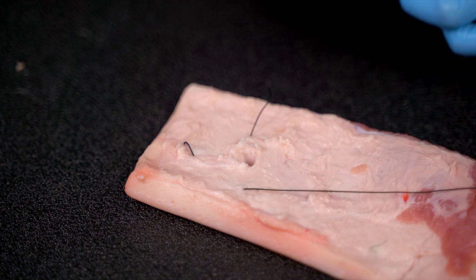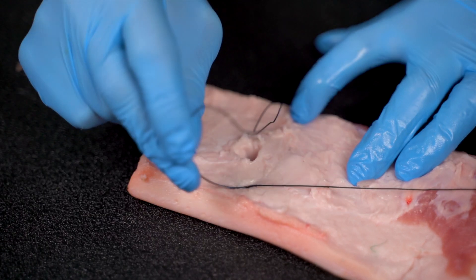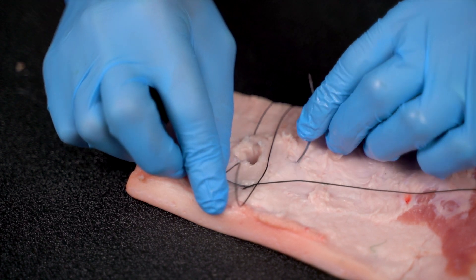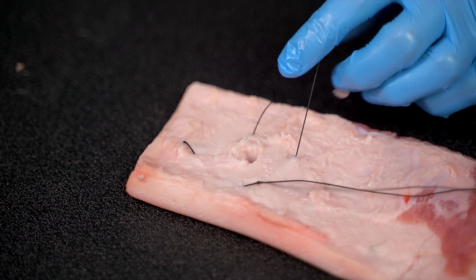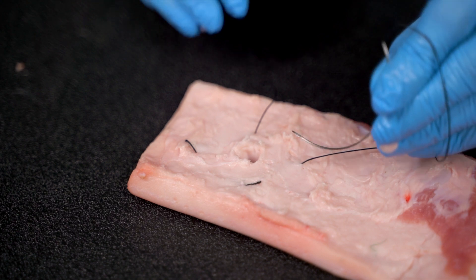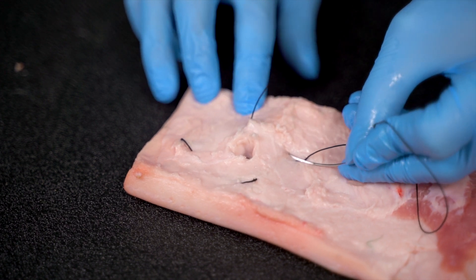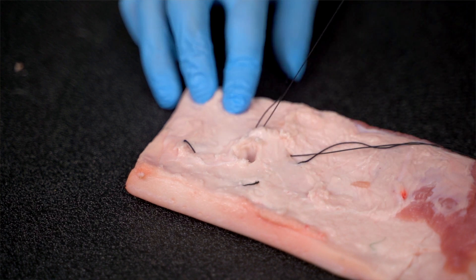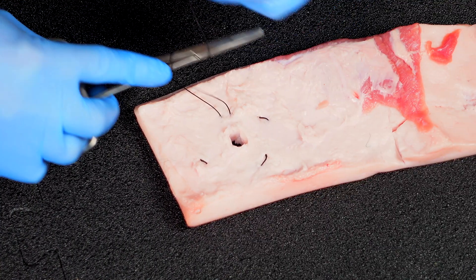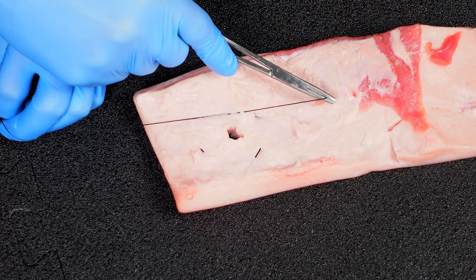Here we go — getting a good start on the wound. When you reach back to the start, having been all the way around, you can then tie your knot. This is an opportunity to hand tie in some circumstances too — see our video on that. As you pull it tightly, you should see the defect close and the wound edges pucker up nicely, so there is minimal tension on the edges and they can heal well.